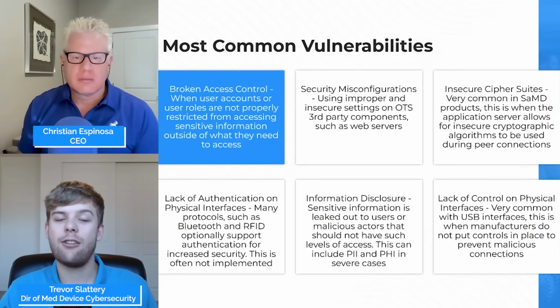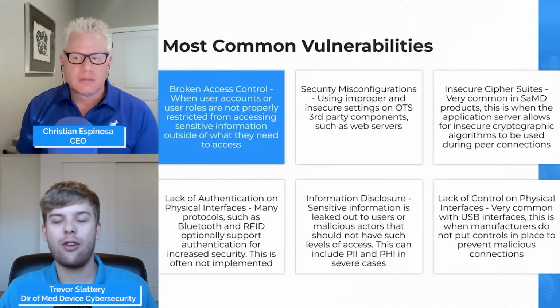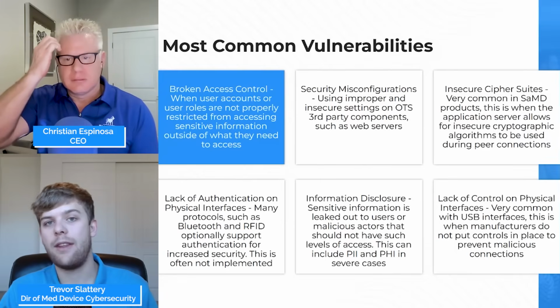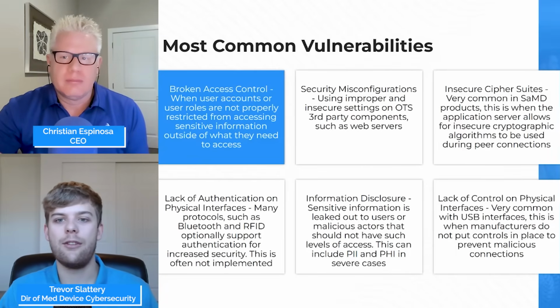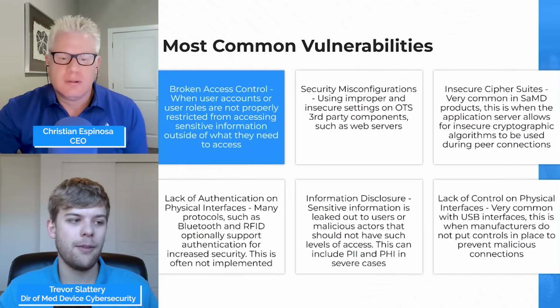This means that there's a potential for an attacker to capture that information and decrypt it in the middle, or they can perform a timing attack to try to determine how the algorithm is being performed and then make some deductions based on what the information is inside of it. It's very important to shelter against these and use only known secure cipher suites. This is also a finding that is explicitly called out by the FDA as something that manufacturers should get out of the system as early as possible.